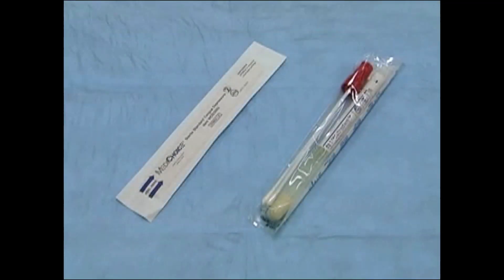To perform a throat swab you will need sterile throat swabs, Dacron or Rayon, which usually come in a swab transport tube with culture media. One or two swabs may come in a tube. You will also need a tongue depressor.